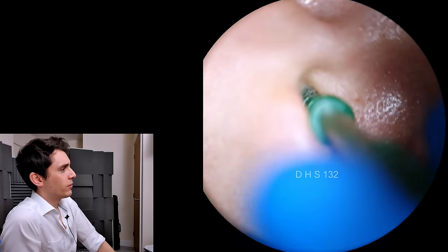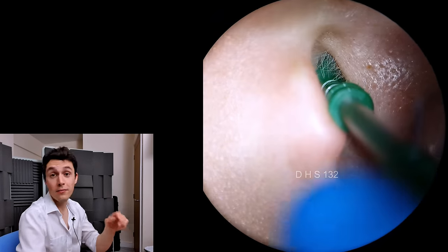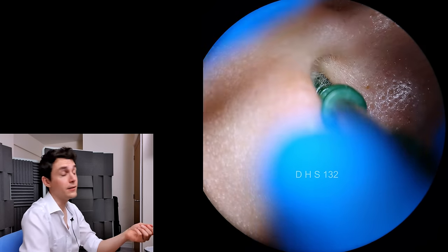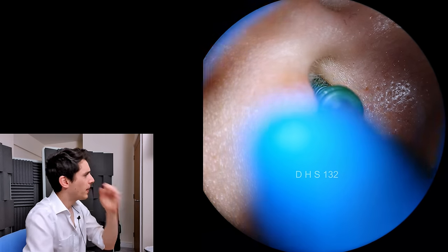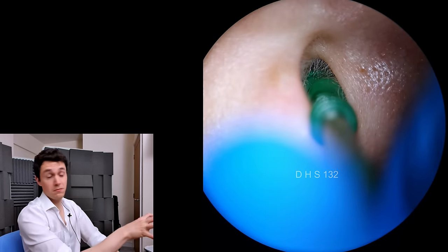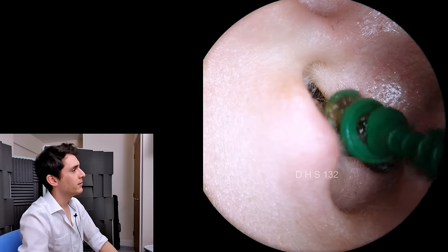Right around here is where I felt resistance in my fingers, and that's a sign that there's no need to advance it into the ear any longer — you just give it a turn. And what we're going to do here is, you're going to see me remove the first chunk of the plug, so to speak. And there we go.